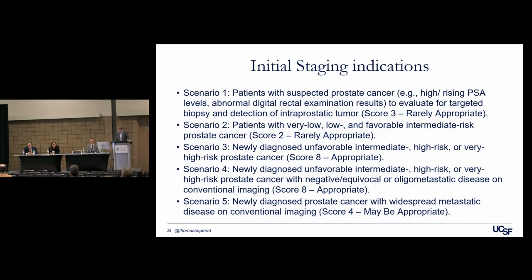And in this setting, there's different areas. So remember, when you think about appropriate use, this is actually important when you order high-end imaging studies in the future, which starts January of next year. You will have to use a decision support tool software to actually get reimbursed by Medicare for these things. So these AUCs are actually going to be pretty important in order for you to actually get your imaging studies done. We obviously, for scenario 3 and 4, these are the indications that are approved.